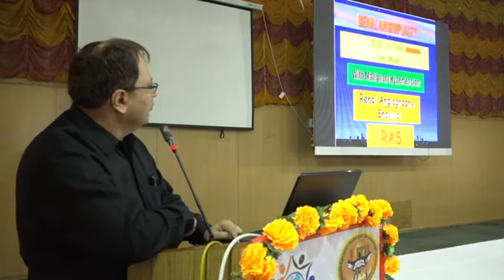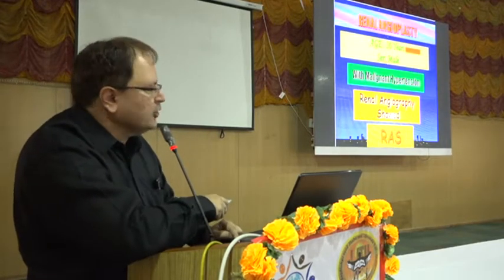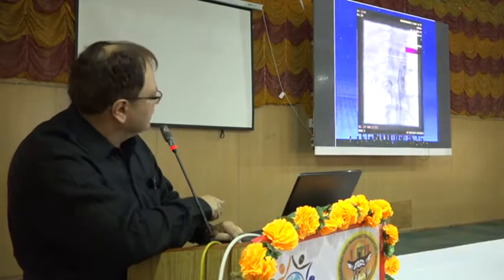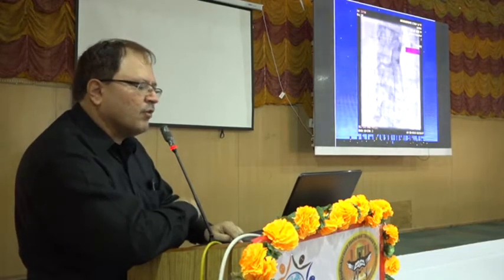Similarly, we have got good stents for renal angioplasty. A young male patient of 20 years presented with malignant hypertension. Angiography showed 99% renal artery stenosis, and we did the angioplasty. After angioplasty, it is absolutely fine. His blood pressure is controlled with one drug only.